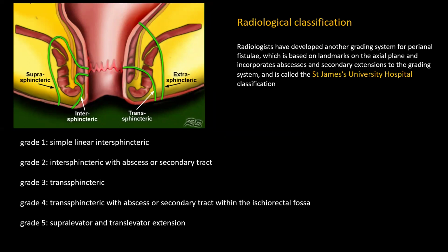So it doesn't make a difference whether you give Parkes classification, or St. James classification, or you give no classification. The way I report, I usually do not give classification. What I do is I give all the relevant information. That is what your surgeon needs. Now there is a template for it. You do the reporting in that template, give them all the information, and they are happy.